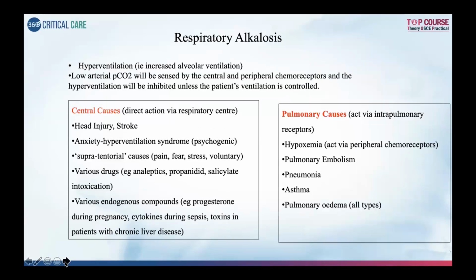So we have discussed most of our bedside calculations of ABGs. This is the Boston approach, or the physiological approach. If you need to know what other methods you can use to analyze the ABGs, this one is very simple, easy to apply at the bedside, and commonly practiced.